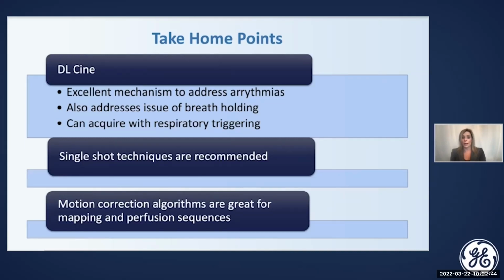Single shot techniques are now recommended as we have deep learning image reconstruction to improve our SNR. And motion correction algorithms are also great for mapping and perfusion sequences.